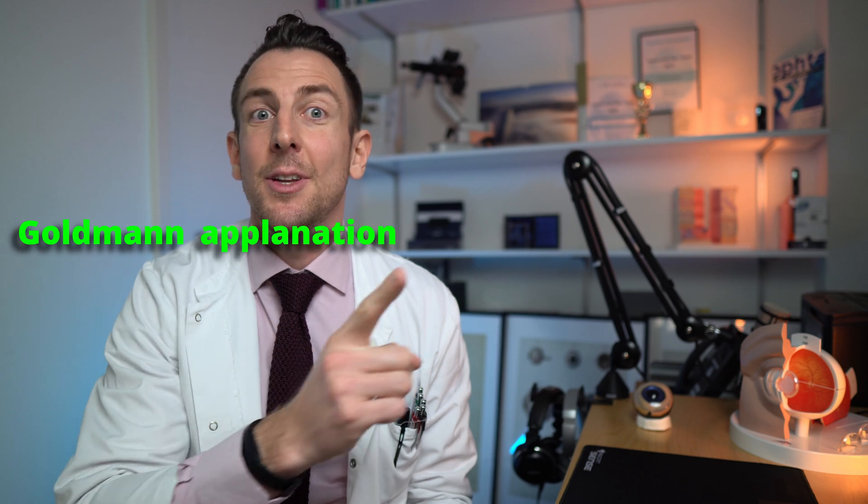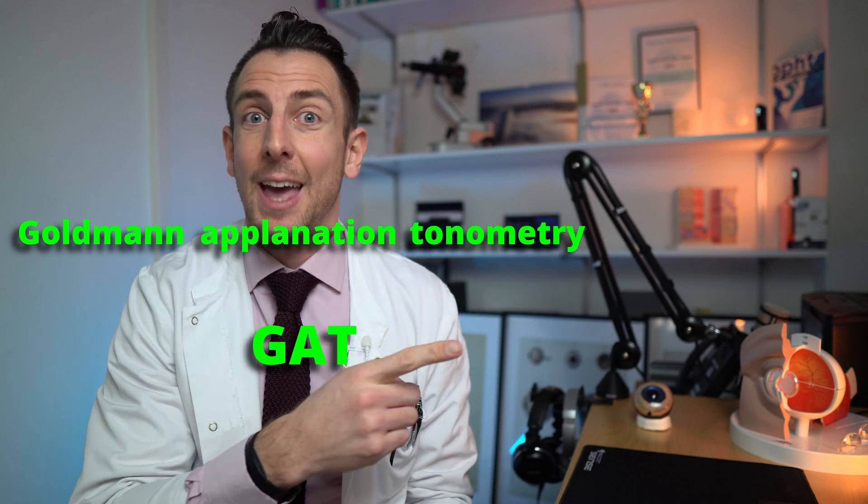Hello and welcome back to LearnAboutEyes.com. In this episode we're going to speak about the Goldmann Applanation Tonometry, or GAT for short. This is a basic exam to measure the eye pressure. While there are of course more simple and easy ways to measure eye pressure, the GAT is still the gold standard and has to be learned by every new resident.